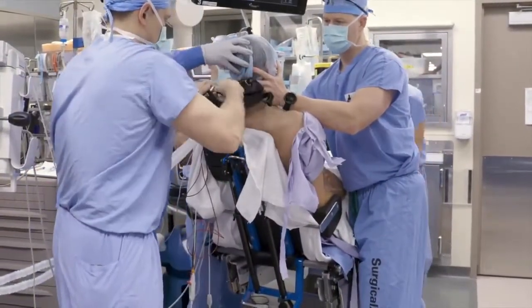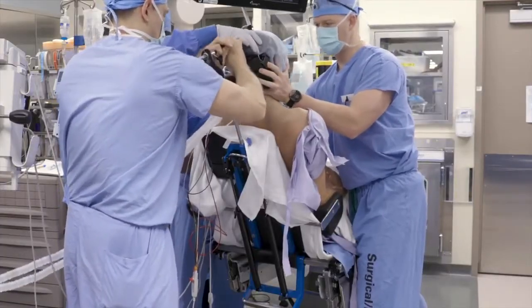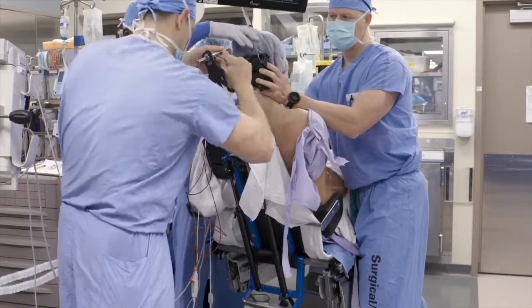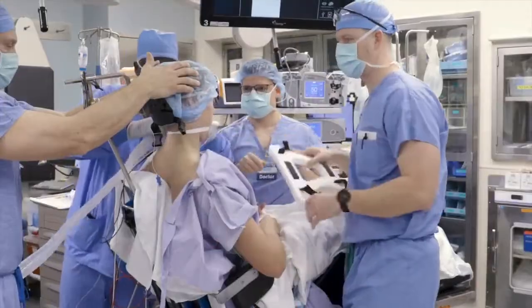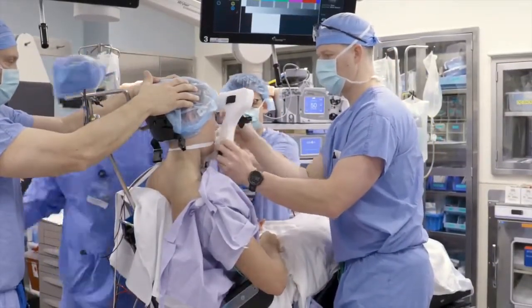We then completely loosen the articulating head holder and bring it up to the patient's head. Once the proper head position is maintained, it's easier to bring the head rest to the patient to safeguard that the patient's neck is in a neutral position. The head is then secured in place with a foam face mask, which is applied to the forehead and to the chin of the patient.